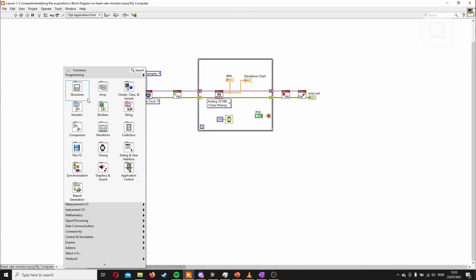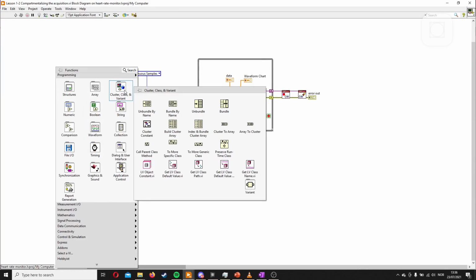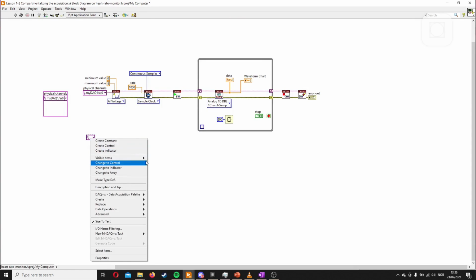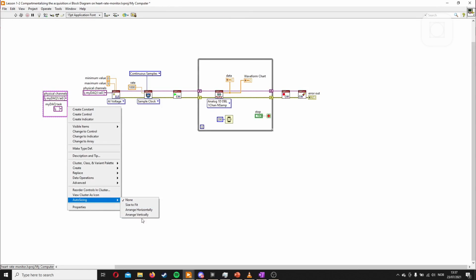So we'll start by creating a cluster. We want the cluster because when we separate things into different VIs, it would be nice to have one common cluster that goes in and out of all of them. So if you forget a data point, if you forget something, we can just update it everywhere. You can find the cluster here, cluster constant, boom. We want the physical channel, because this is the channel we select, and we also want the task. So we create a constant, and this is the task out. We'll get the name here, we'll call it the myDAQ task, and we'll place it in here. And to make it more orderly, we'll just auto-size it vertically.